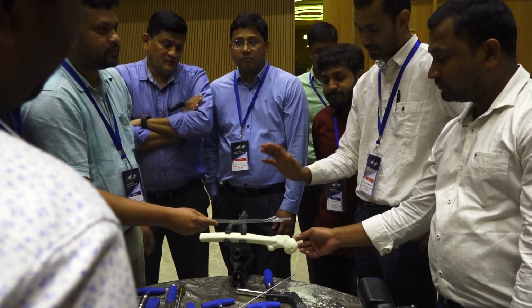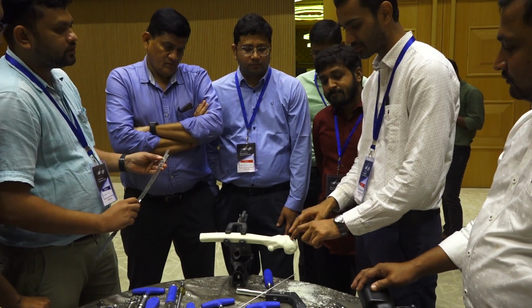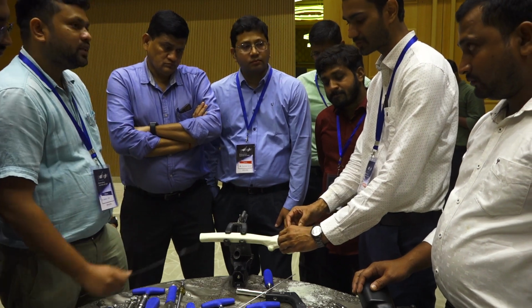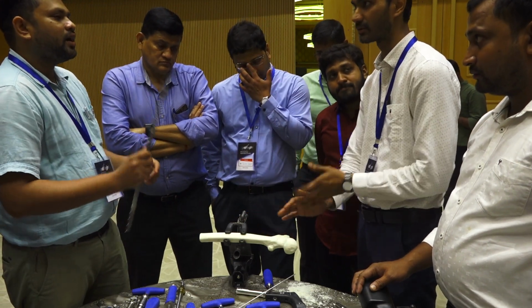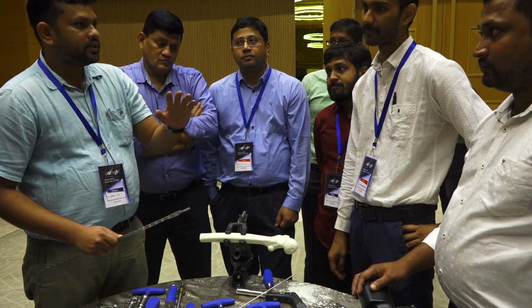It has to be in the center. If your reduction is perfect, your GT will match up to the center of the femoral head. If this is not lined up, then the fracture may be in varus or excessive valgus. According to their manual, the nail should always flush the GT. That is not the case.